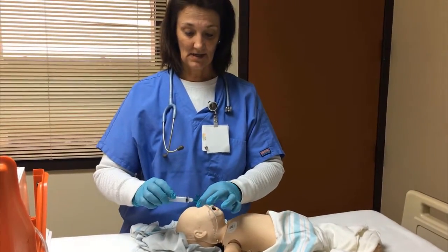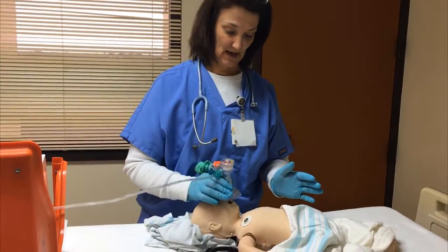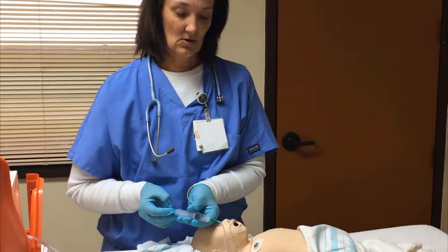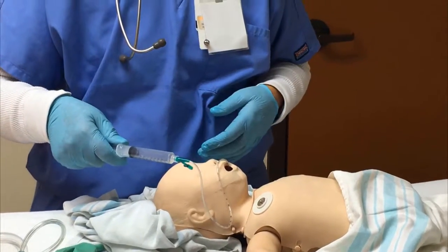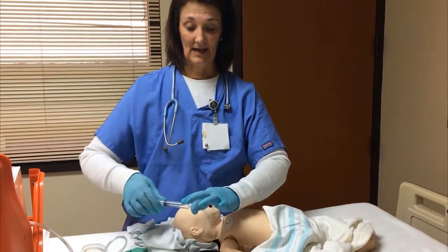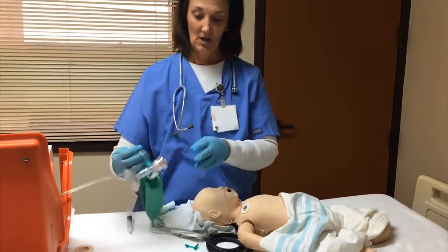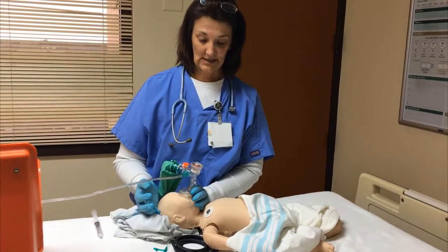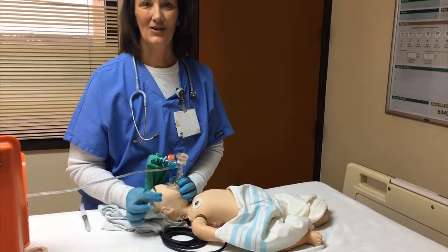So what I can do now is I can go ahead and attach the syringe, and of course any positive pressure ventilations or CPAP can continue. But what you will be doing is pulling back on the orogastric tube to remove any gastric contents or air that is trapped in the stomach. Once you feel like you've removed everything that you can, go ahead and take the syringe off, and you can leave it open and out. That way, once you're continuing your CPAP or positive pressure ventilation, if any air does go down into the stomach, it will be released by your orogastric tube.